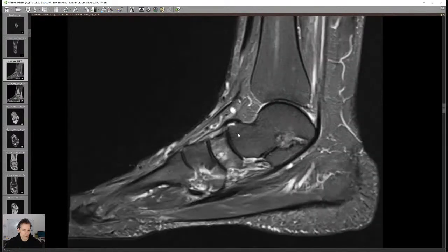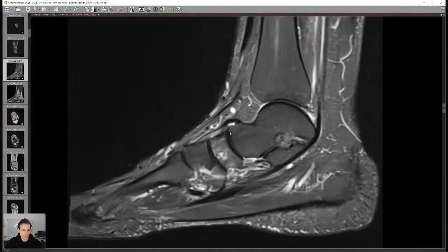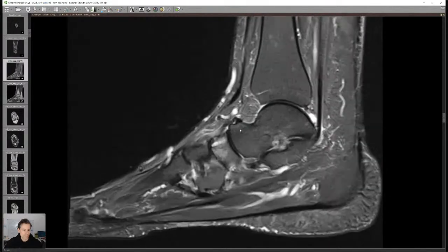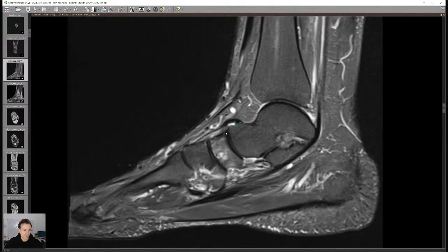This is the Chopart joint — the talonavicular joint. We can already see some bony growth here where the joint capsule is inserting, with some mild osteoarthritis here.